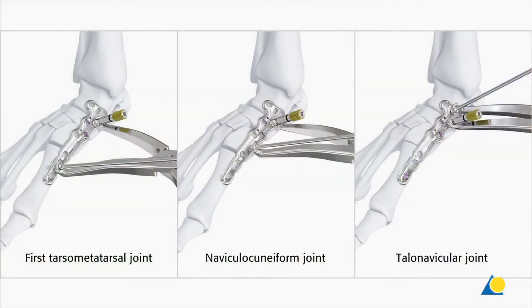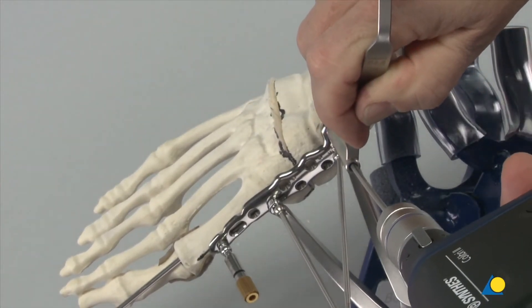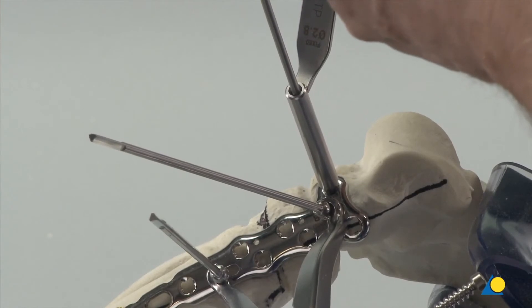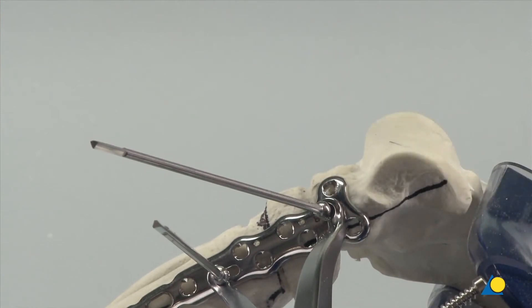In some instances when compression is intended, the compression-distraction rod could be used in place of one of the compression wires. A 3.5 mm VA locking screw will be inserted coaxially into the lateral hole in the talus part of the plate. A 2.8 mm hole is drilled to the desired depth through the coaxial end of the VA double drill guide 3.5. Clinically, this can be done under image intensifier control.